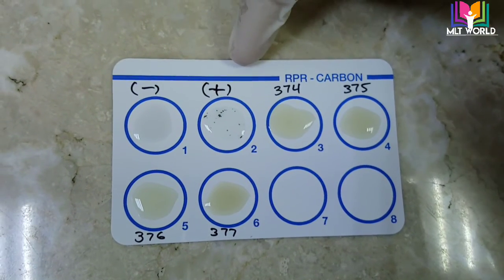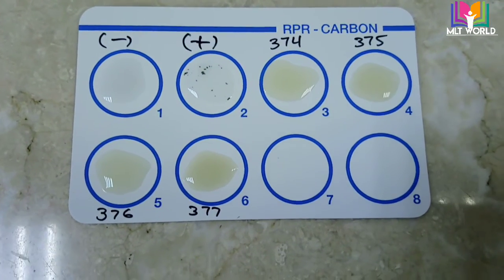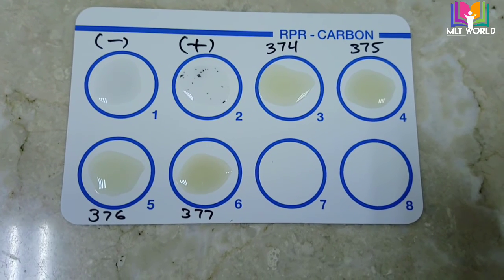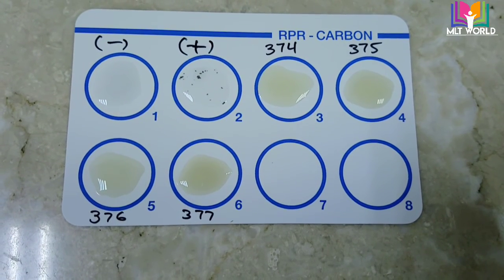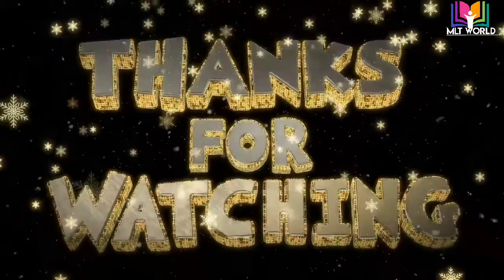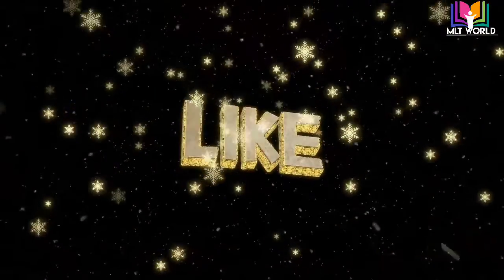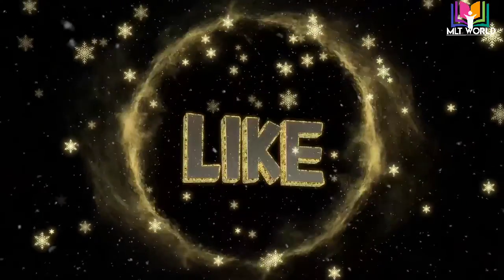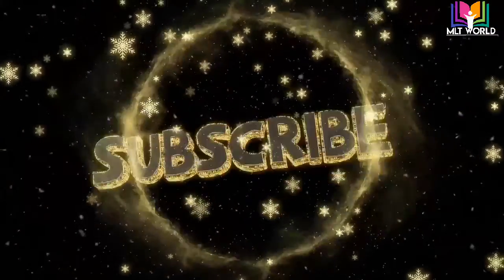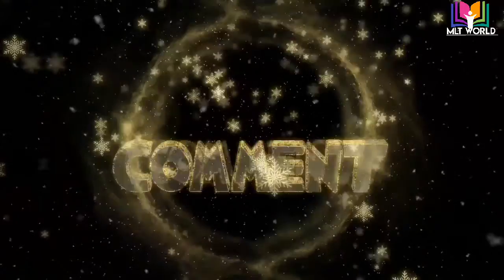You can see that the negative control shows no agglutination, while the positive control shows good agglutination — this means our reagent is working correctly. Patient samples 374, 375, 376, and 377 also show no agglutination, so these patients have a negative result. We can report this as 'RPR non-reactive.' I hope you liked this video and understand how to perform the RPR test, especially using the Spin React kit. Please tell in the comments whether you understood how to perform this test. Thank you so much.